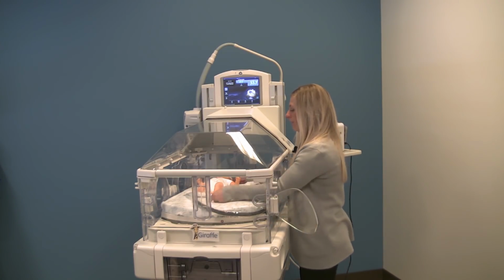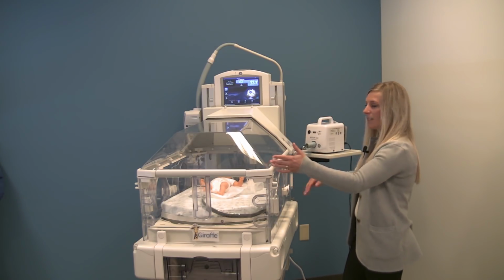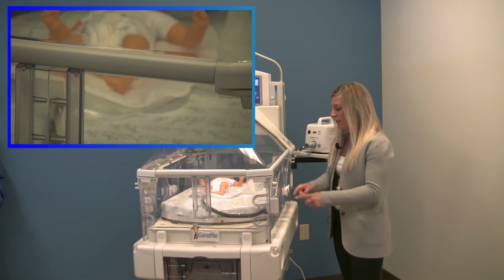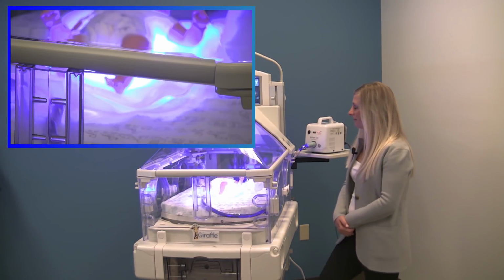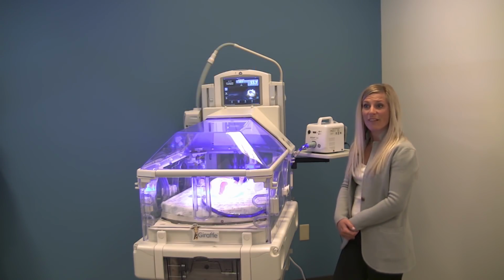Okay, so now your baby can be south end, north end, sideways even, really, in that bed, and you can have a way to thread the cable and access the baby. We can turn it on because we did. Yep, move it over for you. Okay, all right. Thank you for that question.